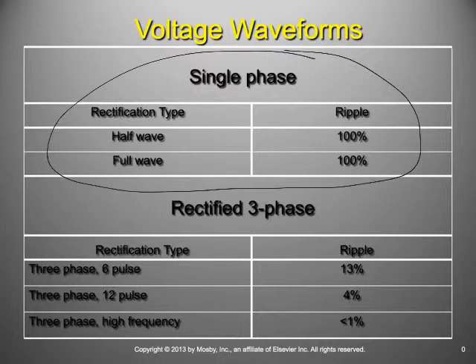In America, we use alternating current, right? And I'm not exactly sure how this would work in Europe or what have you. But I know for sure that when we're talking about alternating current, I am applying a form of electricity to this X-ray tube that's oscillating like this, right? That's alternating current.